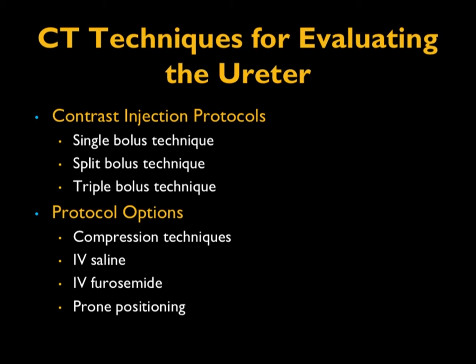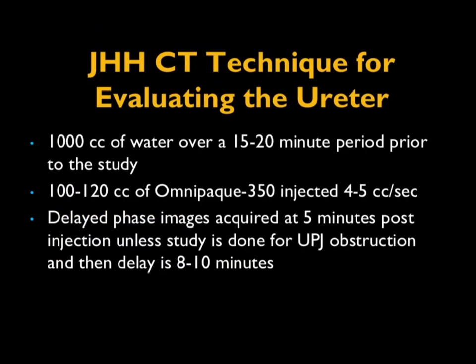In a sense, we've modified the protocol to make it pretty simple. We give our patients 1,000 cc's of water over about a 20-minute period prior to the study. The patients, when we give IV contrast, are going to be excreting urine. Lots of water distends the bladder. We also tell the patients not to go to the bathroom before they do the study. Sometimes everyone wants to go to the bathroom. They get a little bit nervous, but we like the bladder to be distended.